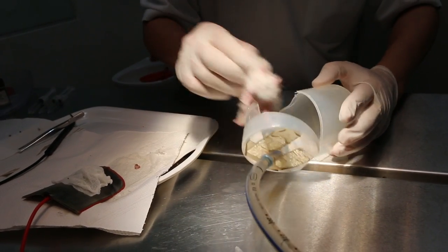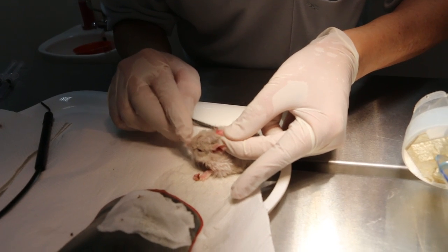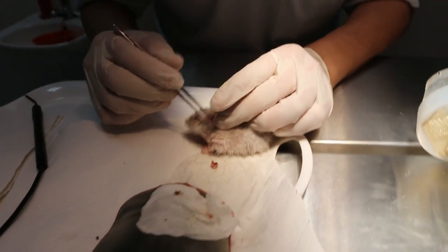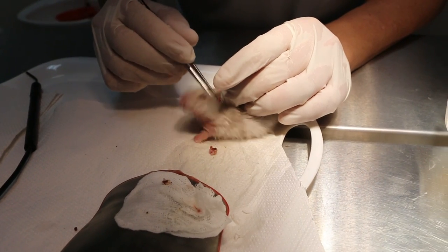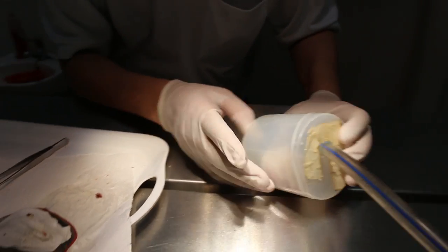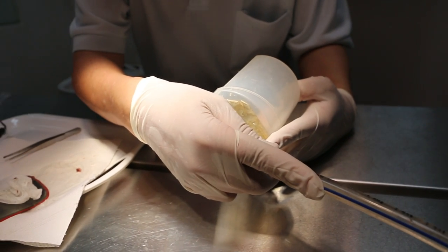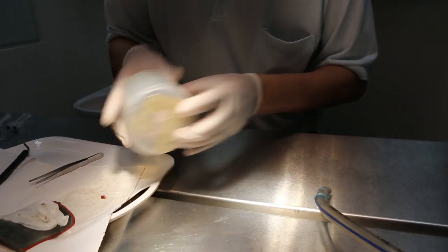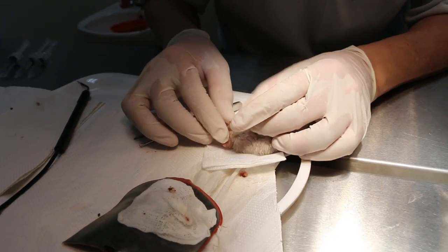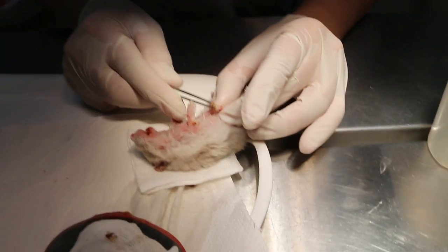Now to clean the ears. Both ears are actually dirty. Normally it's due to the sand and the dirt. Now he's awake again, so I have to put it back again. One, two, three, four, five, six, seven, eight, nine, ten. In the ears, check again. Okay, one. This is the scent gland. A lot of dirt, so I just clear out the dirt.